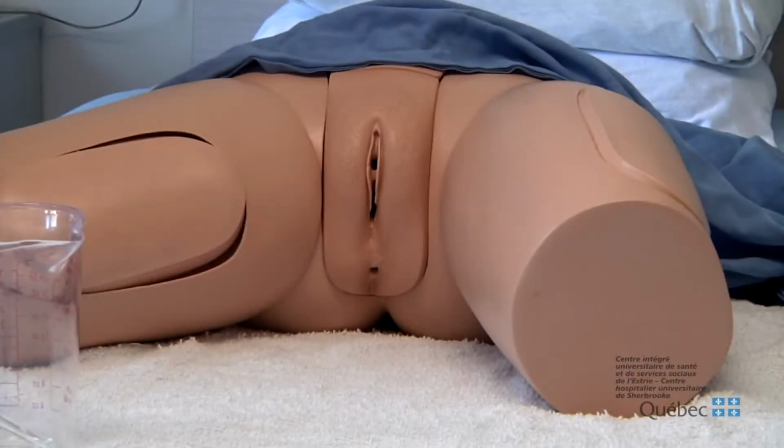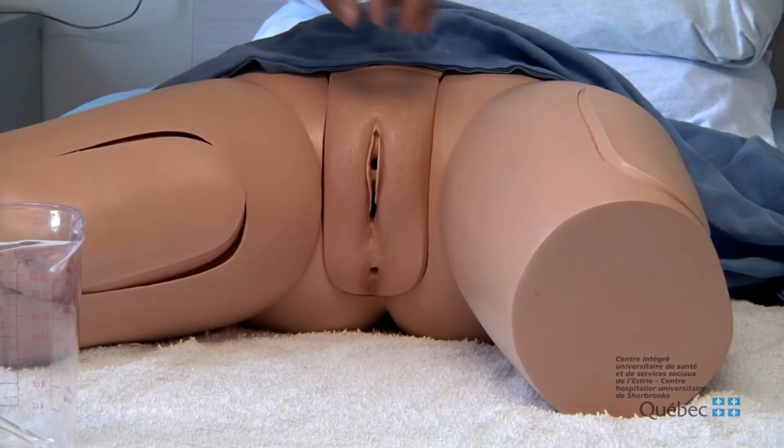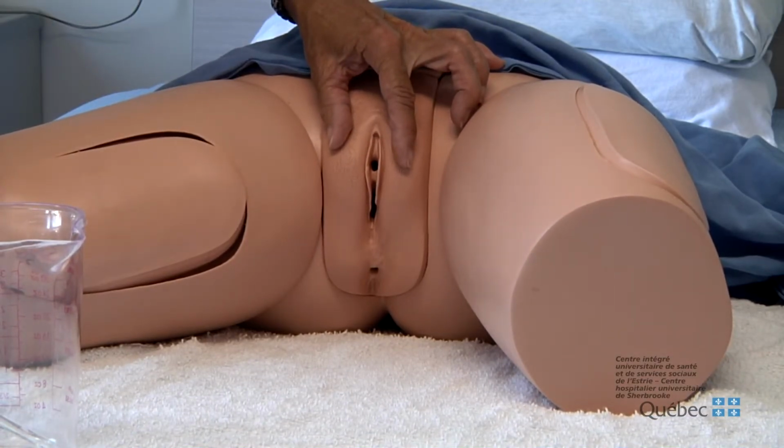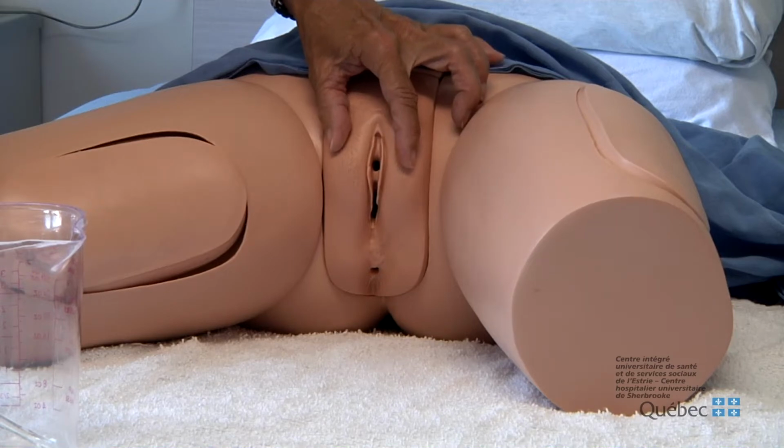If you are right-handed, use your left hand to spread the outer lips of your vulva. If you are left-handed, use your right hand to spread the outer lips of your vulva. You will need to keep your outer lips separated until the catheter has been inserted.